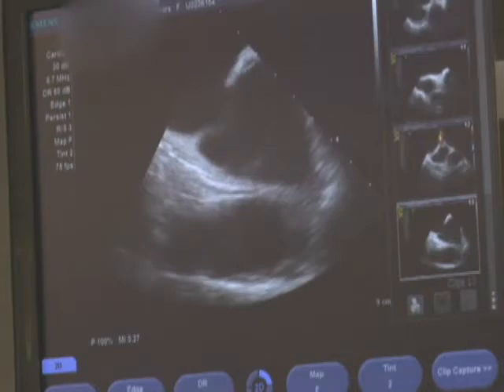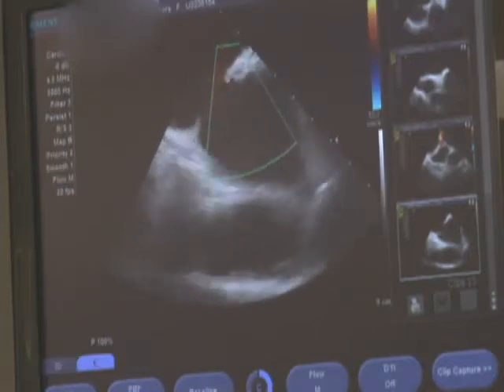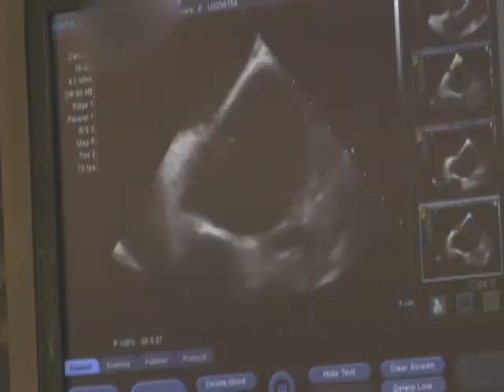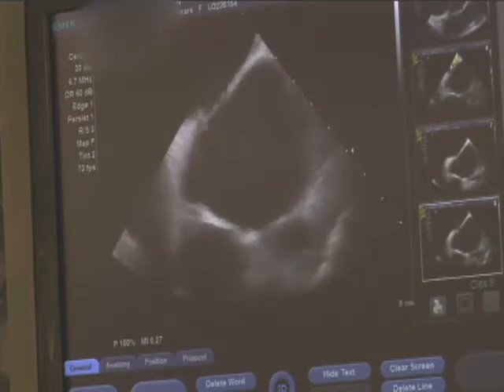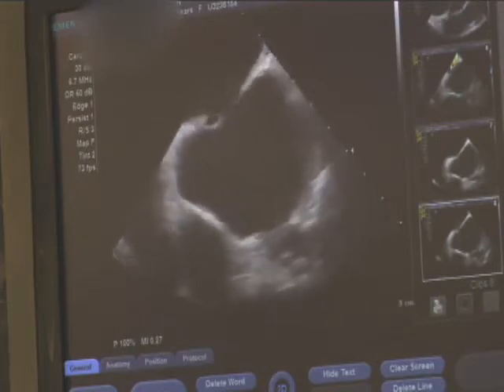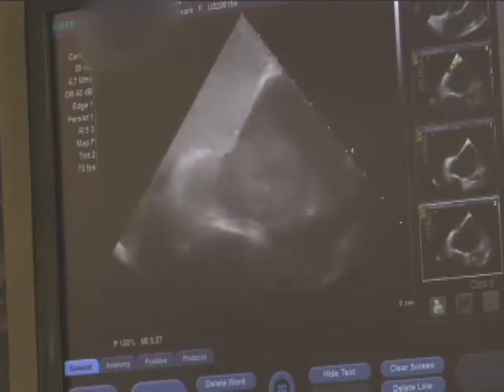This ICE image demonstrates an atrial septal aneurysm. Color flow does not demonstrate any flow disturbance or shunt. However, a saline contrast study while the patient performs a Valsalva maneuver shows passage of microbubbles from right to left across the interatrial septum consistent with a patent foramen ovale.